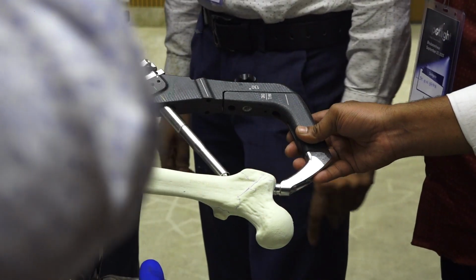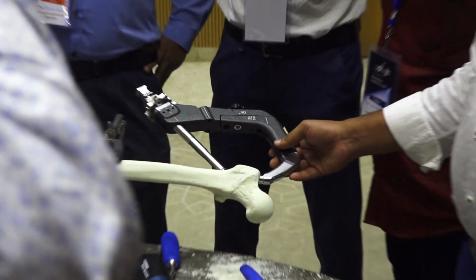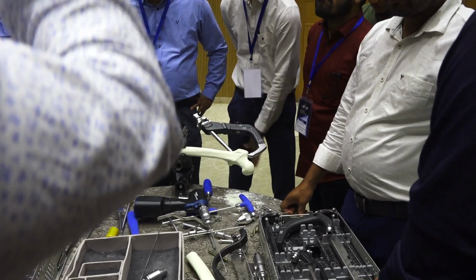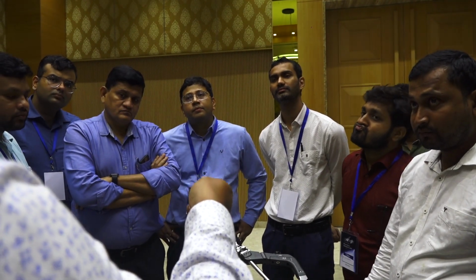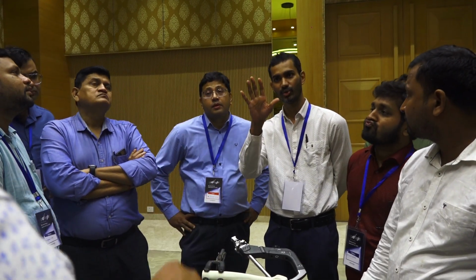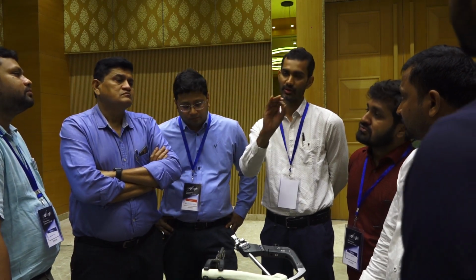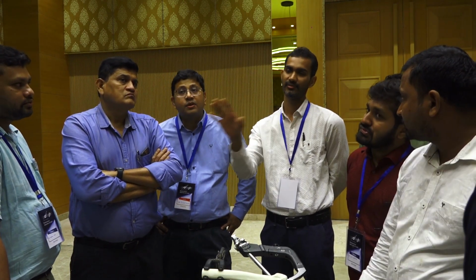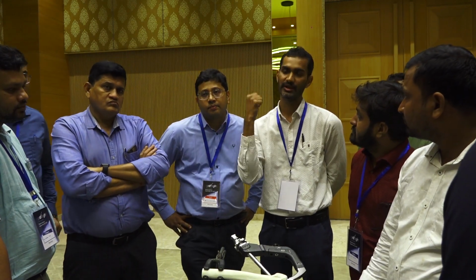Sir, when we are holding the fracture fragments, I mean, we are giving the guide wires, K-wires, anteriorly and posteriorly to hold the fracture fragment. So when should they be removed? After nailing or before nailing? If you have correctly placed both these K-wires in the perfect anterior and posterior position, the nail will not cause any problem. You can put the nail. After putting the nail, after putting the helical blade, you can remove it.